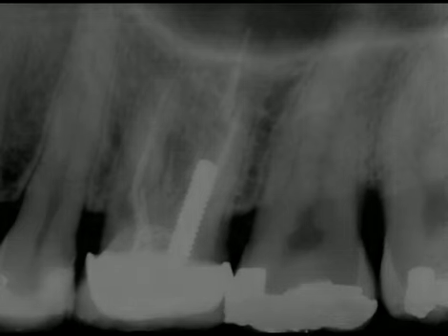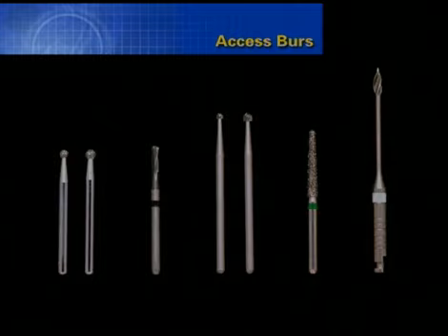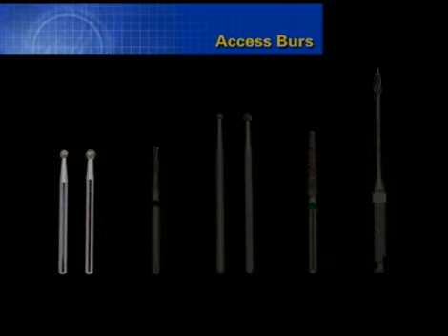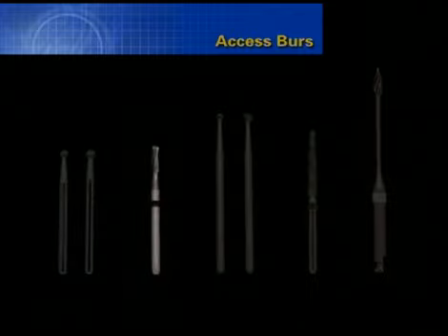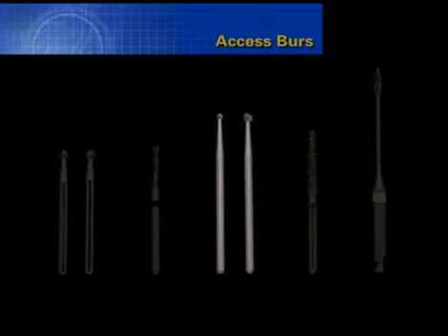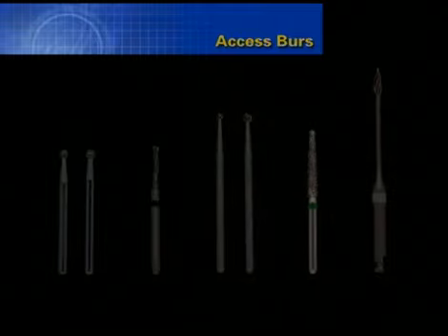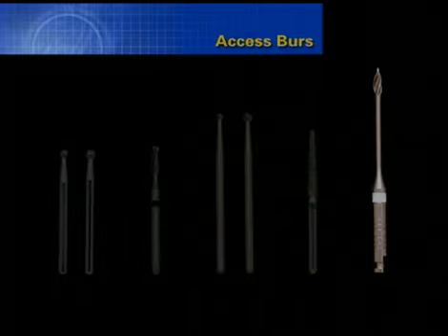Importantly, preoperative films show us the length and diameter of a post and if the post is centered in the root canal. The armamentarium of burrs I recommend for endodontic retreatment are number 2 and number 4 round burr diamonds for accessing through tooth-colored restoratives, a transmetal burr for accessing through alloy or precious or non-precious metals, surgical lengths number 2 and number 4 carbide round burrs, a surgical length tapered diamond, and a variety of Gates Glidden burrs to flare the orifice and provide a smooth transition from the axial walls into the root canal space.